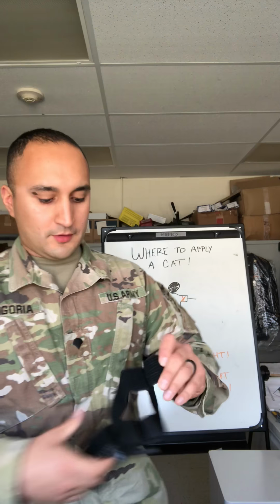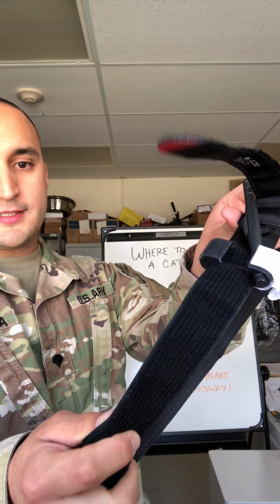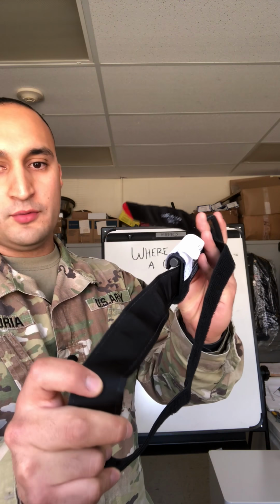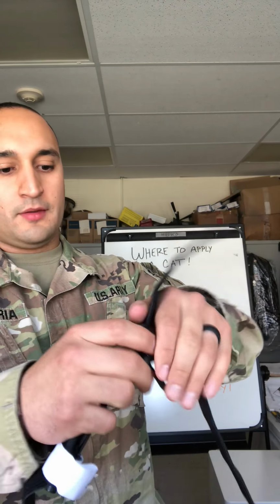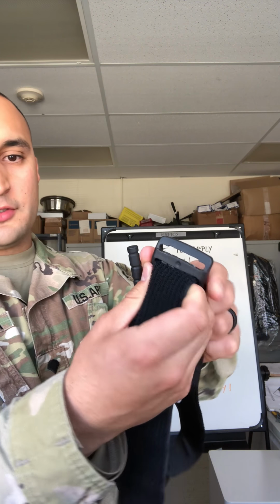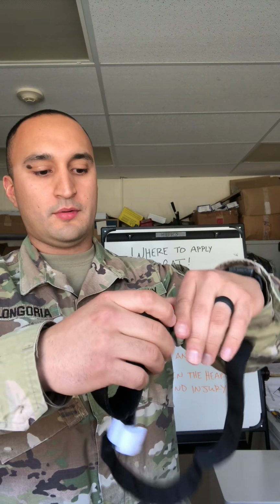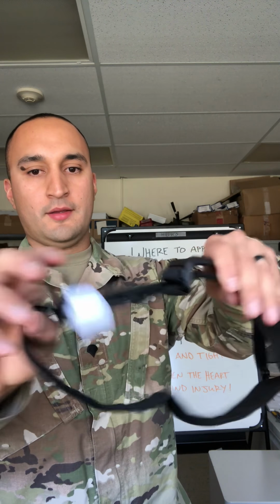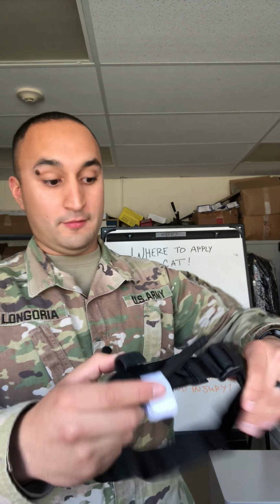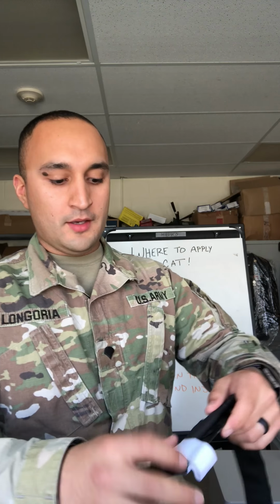The CAT tourniquet is simply a one-sided Velcro, one smooth-sided piece of equipment with a friction adapter similar to a belt loop that allows you to wrap around an extremity of an accident victim, or a casualty as you can call it.